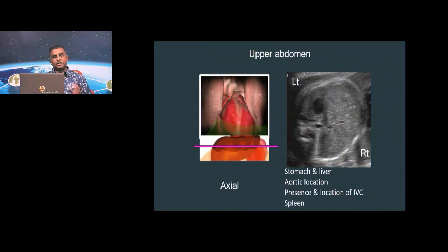And that's extremely, extremely important, to mark the sides of the fetus. Having marked the sides of the fetus, I know that this is left and this is right, because the spine is here and I have done the scan. This is a cephalic presentation. The head is in the lower pole of the uterus and the breech is in the fundus. So in this orientation, if I put myself in the fetal position, I know my left is this, my right is this, and therefore the fetal left and fetal right.